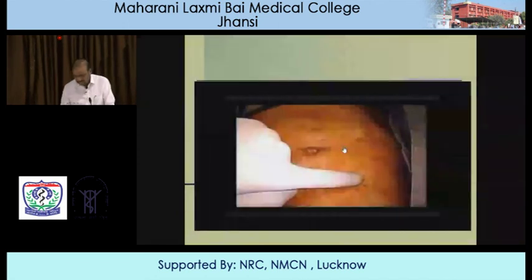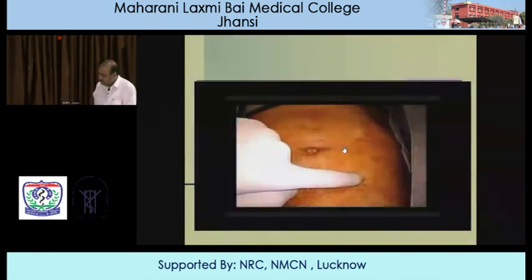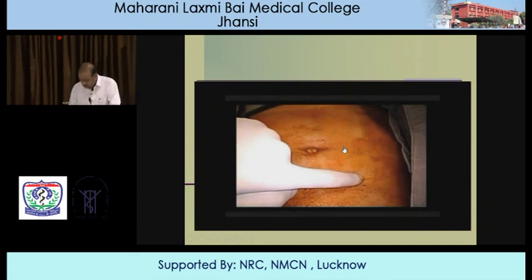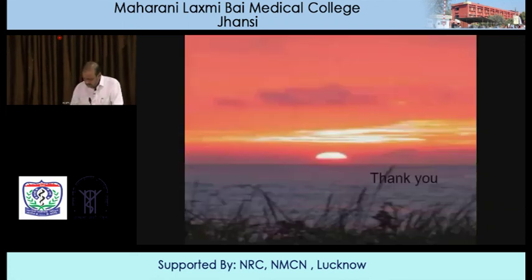is so very small. Now see, this is the umbilicus, and you have this opening above the umbilicus. This is the pubic bone, and this is towards the xiphisternum. You see, this opening is above the umbilicus. In a TEP you would have done it below the umbilicus. So this is a supraumbilical approach, otherwise just the same, just like in a TEP repair.